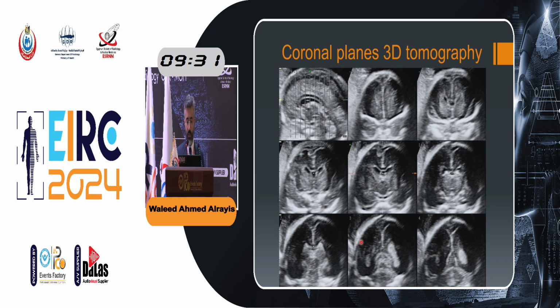We can use 3D tomography to have various or successive planes from this sagittal view, and we have many coronal planes to assess the fetal brain in coronal successfully.